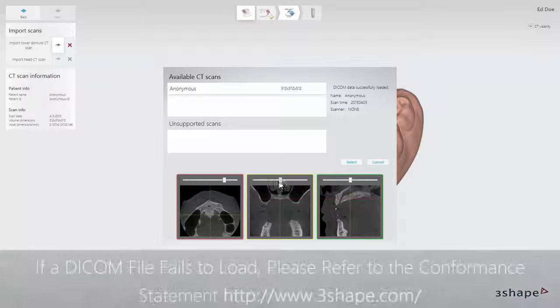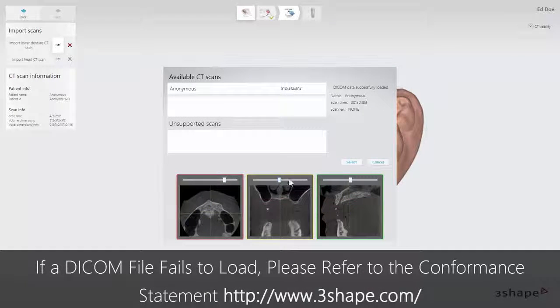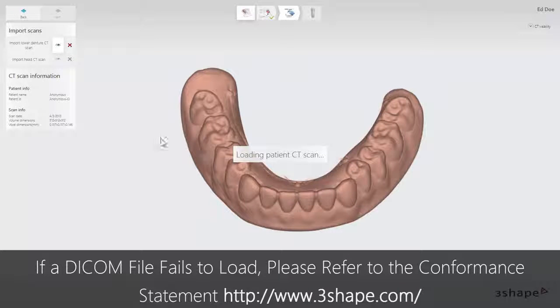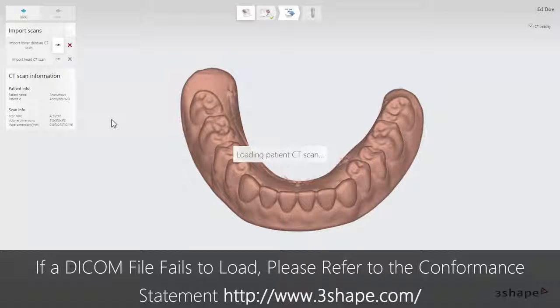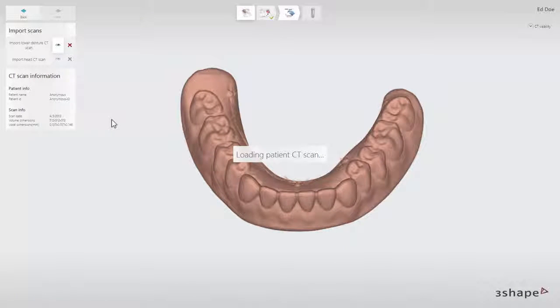If a DICOM file fails to load, please refer to the conformance statement or alternatively contact your CT manufacturer for clarification. The 3D preview for the head scan will appear on the screen.